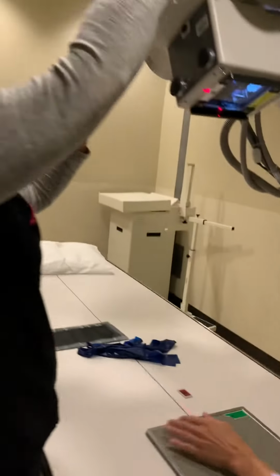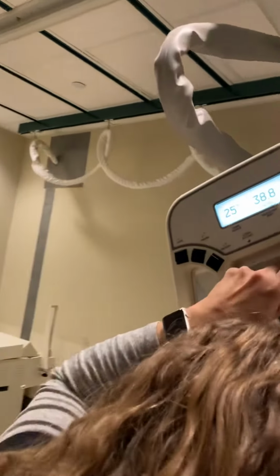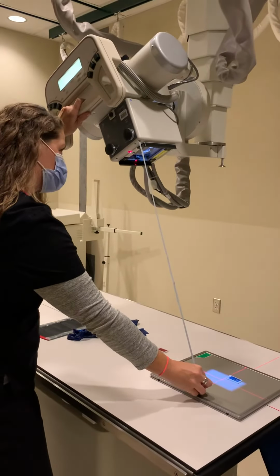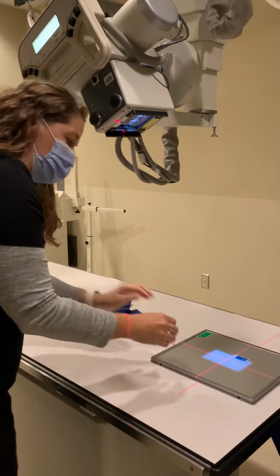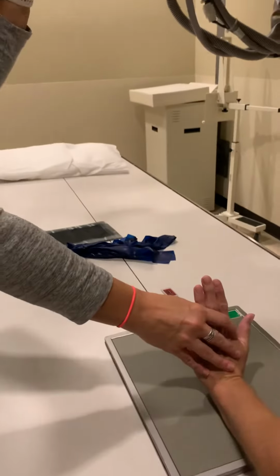Next, we will demonstrate the tangential carpal canal. Patient seated at the end of the table. We have a 10 by 12 lengthwise. We are going to use a 25 to 30 degree angle toward the wrist. For lab practice only, we will use 25 degrees.